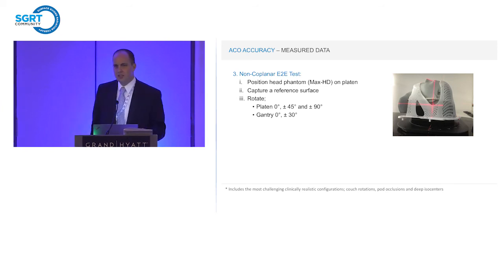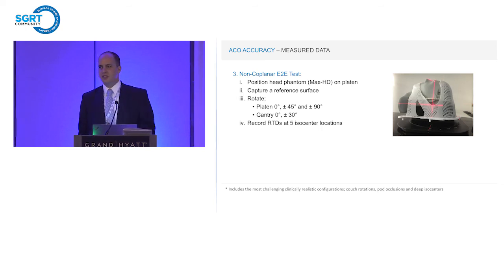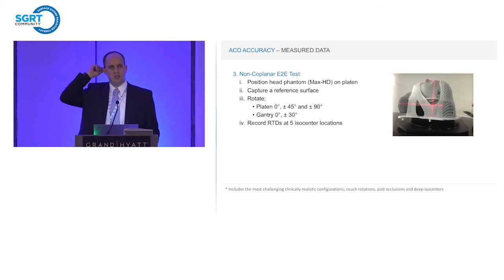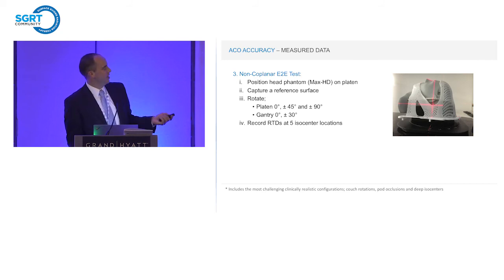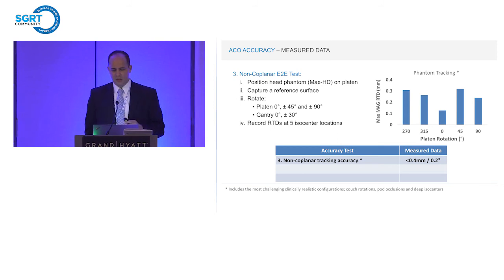Not only did we run through these tests for one isocenter, but we looked at the effect of different isocenter depths on the surface tracking ability. We had a question in the physics session earlier about the location of the lesion and its dependence on surface tracking accuracy. So we're sensitive to the fact that it could have an impact, so we wanted to test that here. So some of the data from this.